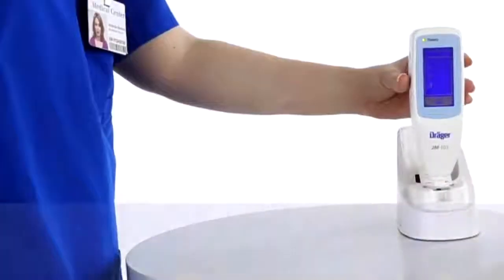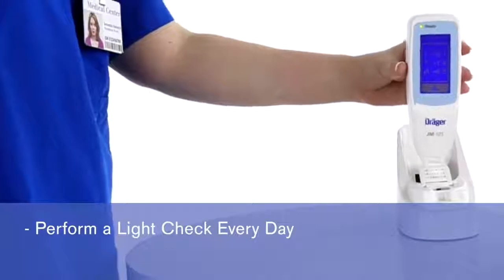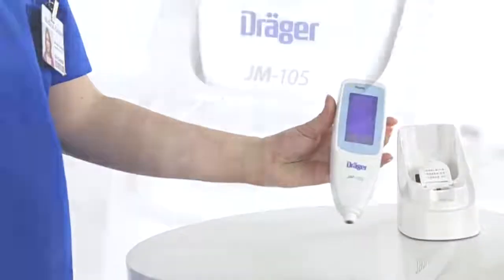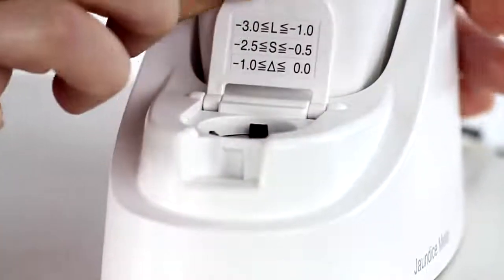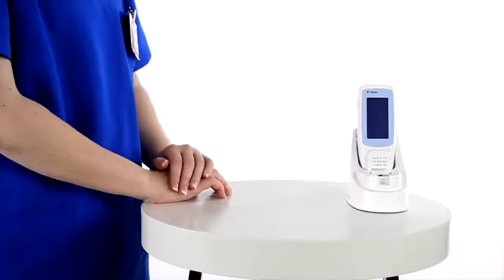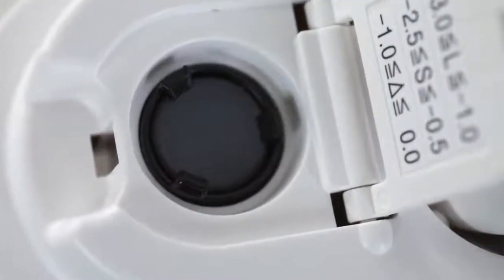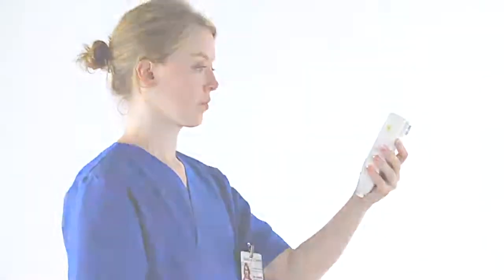The light output of the JM105 should be checked at least once daily to make certain that the light output is within an acceptable range. This is called a light check procedure. The docking station has a built-in light checker for the measuring probe. Open the lid cover on the front of the docking station to reveal the checker surface, a small black circular area. To begin the light check procedure, remove the JM105 from the docking station.